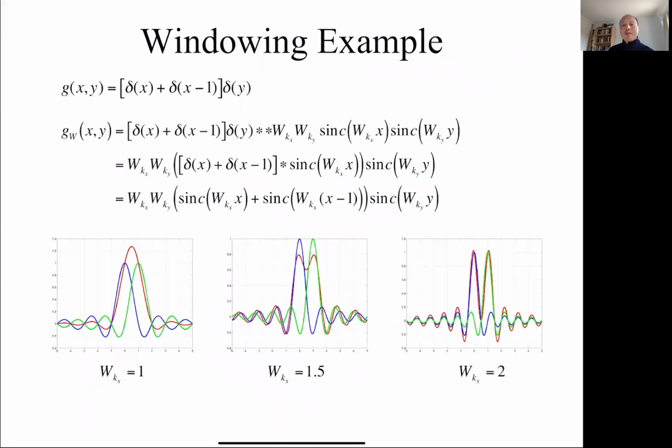The other way you can think about effective width is that it's set up such that if you have 2 dots and you convolve them with sinc functions. So if my original object had 2 Dirac delta functions, that was my ideal object. After I convolve them with sinc functions, they're each going to get blurred out.